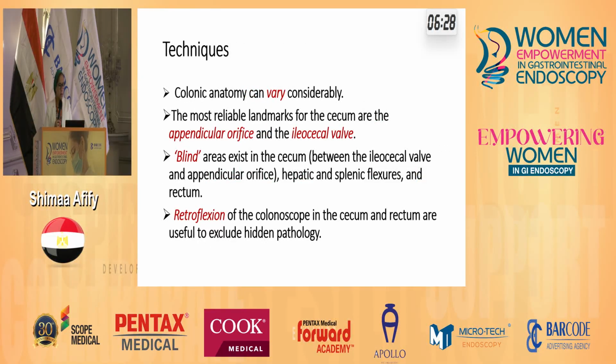Colonic anatomy may vary considerably, as we said. The most reliable landmarks of the cecum, if I want to make sure that I've already reached the cecum, are the appendicular orifice and the ileocecal valve. This is the sure sign that I am in the cecum. I have done cecal intubation.